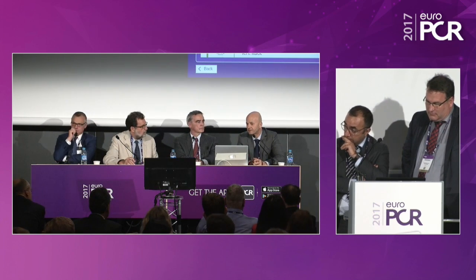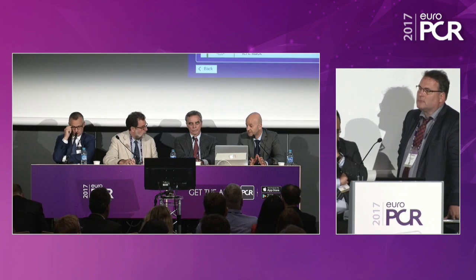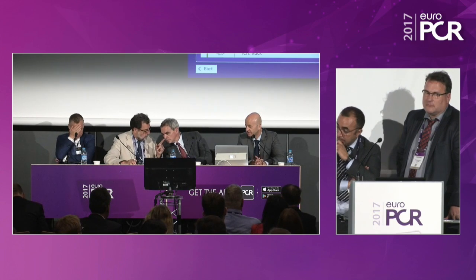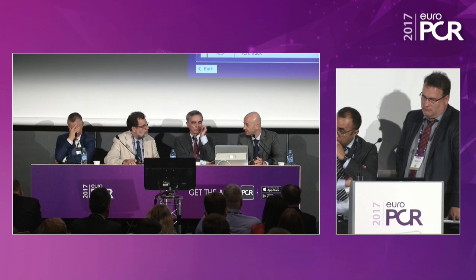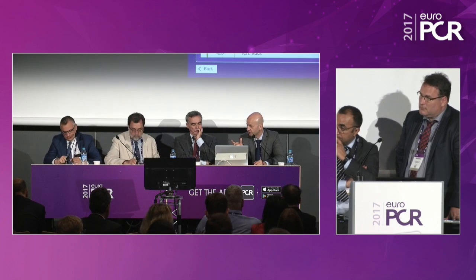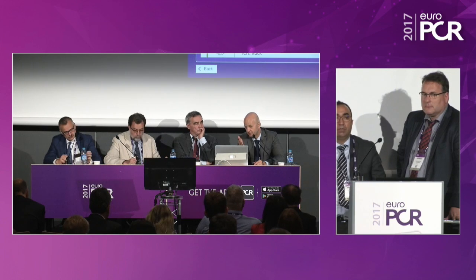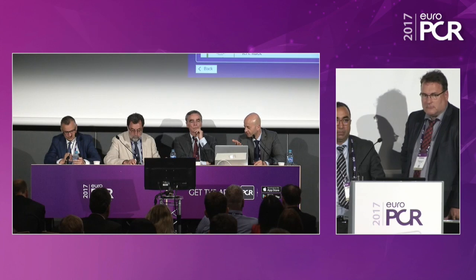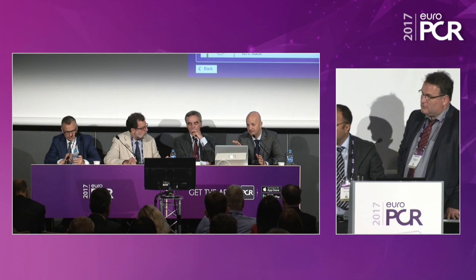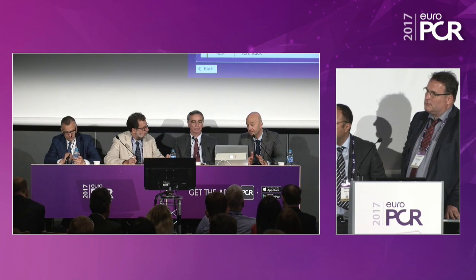I could maybe describe one typical patient we treated with a combined approach. That was a patient with a very severe MR and a very large left ventricle of 72 millimeters in diastole. And we were not able to clip this patient because the coaptation defect was so large and we were not able to grasp both leaflets. So we had to abandon the procedure. We came back with a Cardioband, implanted outside the study, but we knew already the heart was so huge that we wouldn't be able to cope completely with this. So we implanted the Cardioband, ended up with an MR 2, and then came back with a MitraClip because then we could grasp both leaflets and ended with a trace MR.